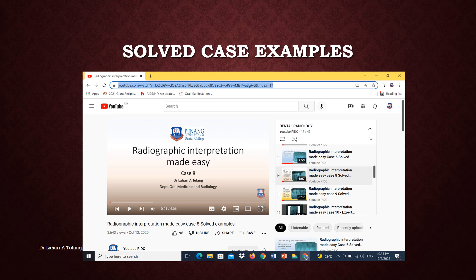In this lecture, I have attached two examples of cases that I have solved for you. One is a maxillary radiograph and the other is a mandibular radiograph, both in the molar region. You could find more similar examples on the PIDC YouTube for better understanding of this topic. I have followed the simple radiographic interpretation format that we use regularly in the clinic for your ease of understanding.